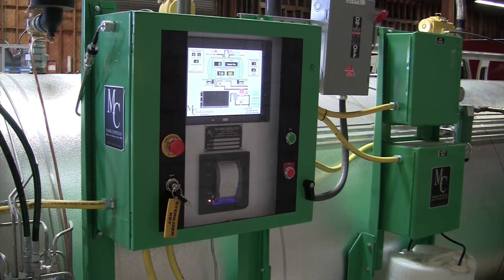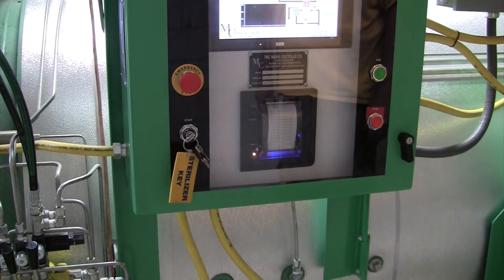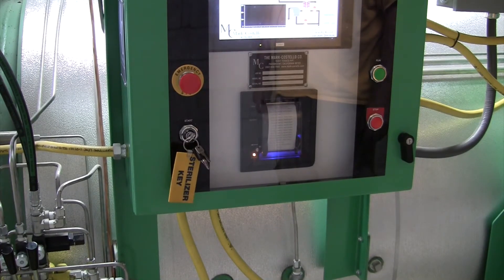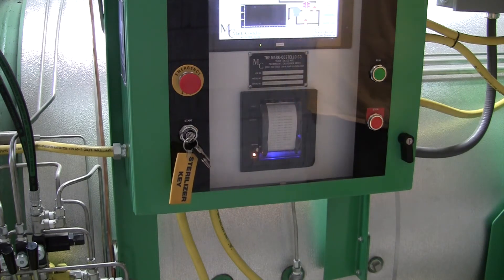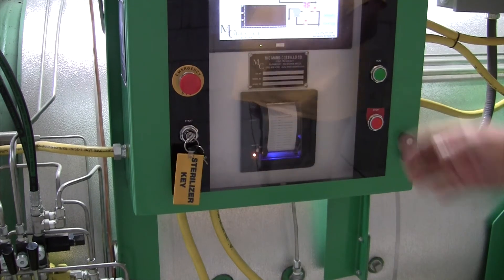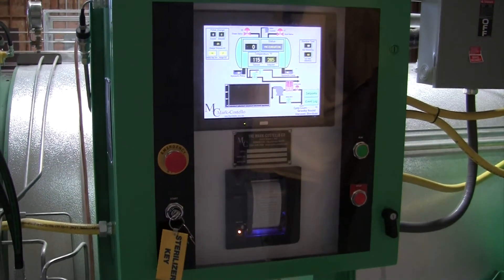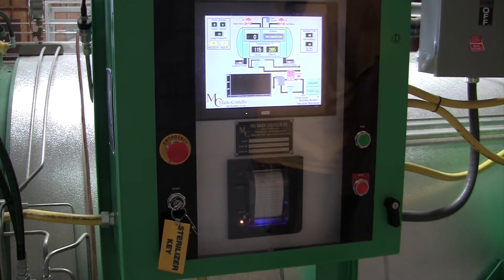I'd like to point out regarding the hydraulics: there is an adjustable timer. These hydraulics can be set to turn off automatically at a set time. This will keep you from overheating your hydraulic pump and possibly damaging it. Once your sterilizer is completely loaded and you're ready to process the load, everything on your information is already programmed in, so you merely need to go to the start key, turn it, and as you can see the screen will show you're starting a cycle. The pump will come on, water will start flowing, and steam will start flowing in its prescribed order.